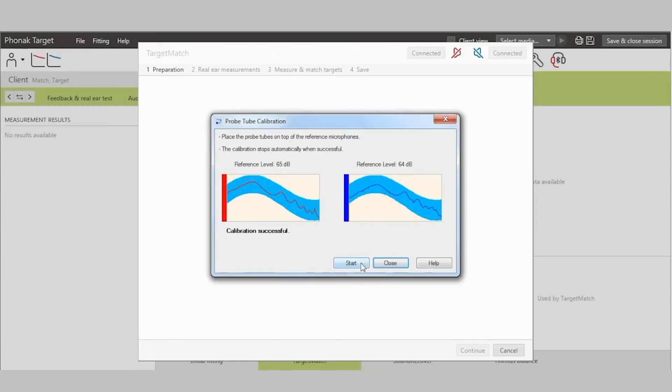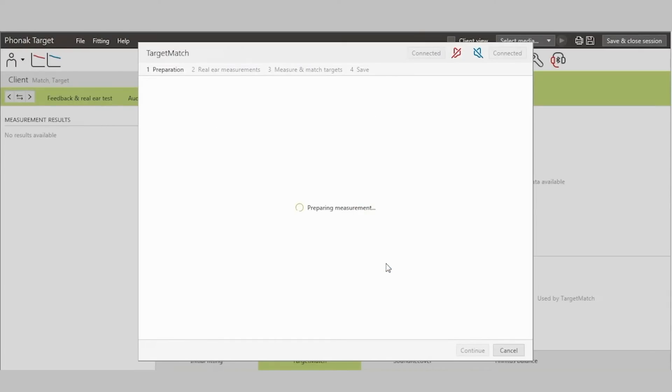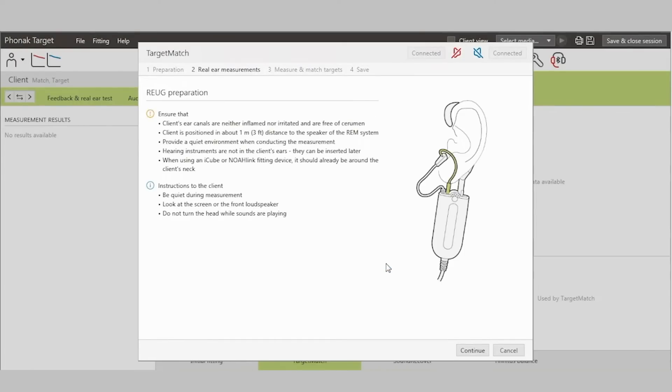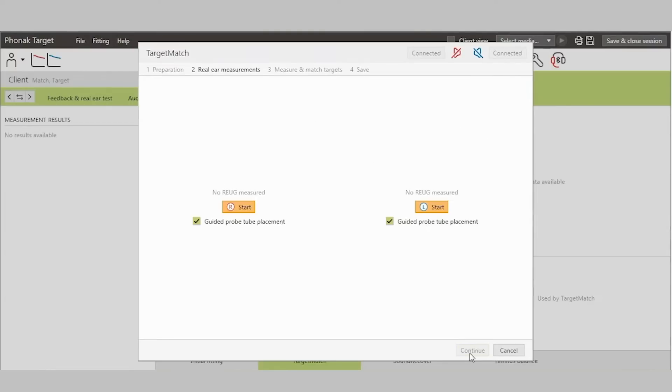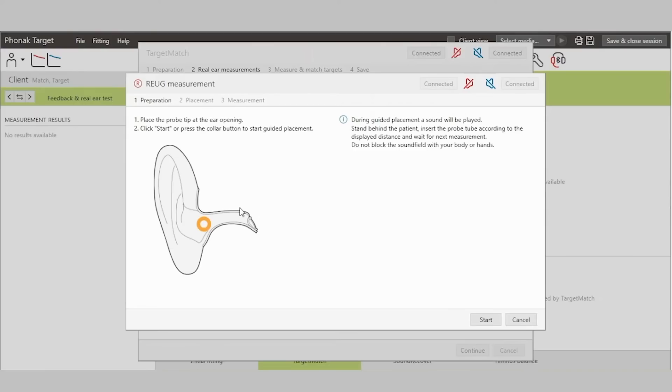Now that my probe tubes are calibrated, I can move on to performing the real ear unaided gain or REUG response. Target provides some reminders of how to place the probe tube in the ear in order to perform this measurement. One advantage of Target Match is our guided probe tube placement. This function provides real-time feedback about probe tube placement.